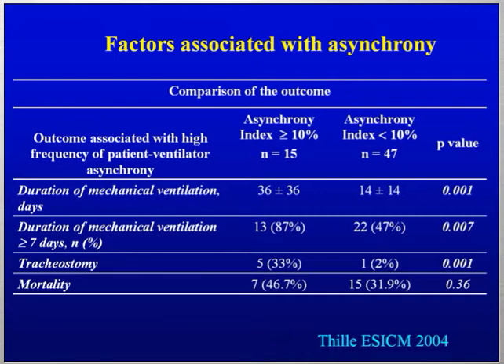Yeah, that's, of course, a very important question, and that's why in the preceding slide we clearly saw that, as we expected, patients who had these ineffective efforts had a higher level of pressure support, higher tidal volume. And we said, but maybe it's because they need more pressure support, their mechanics are poorer. And it was not the case. Mechanics were the same, but PCO2 was lower, pH was alkalotic, really suggesting that there is a problem of setting the ventilator correctly.